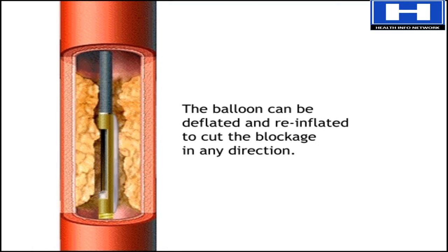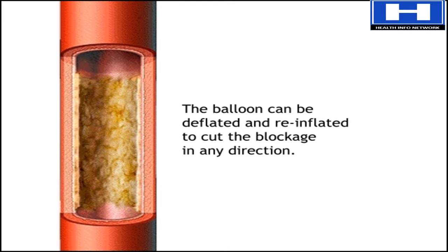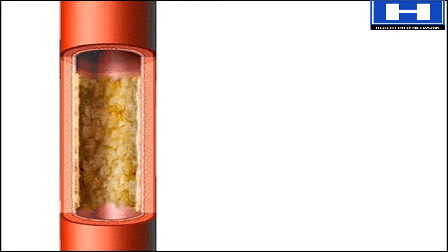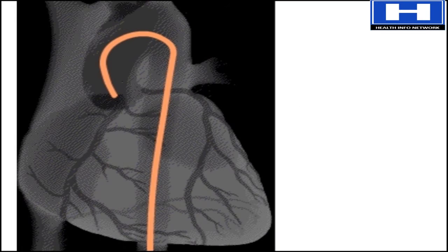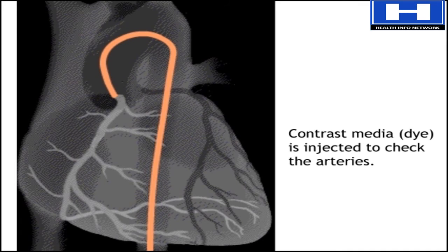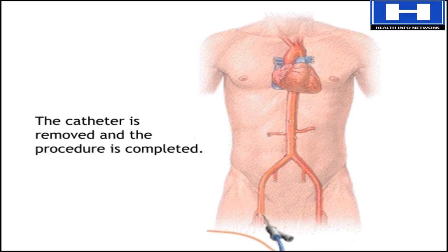Rotating the catheter, while inflating and deflating the balloon, makes it possible to cut the blockage in any direction, leading to uniform debulking. A stent may also be placed — a latticed metal scaffold put inside the coronary artery to keep the vessel open. After the procedure, the doctor injects dye and takes an x-ray to check for change in the arteries. Then the catheter is removed and the procedure is over.